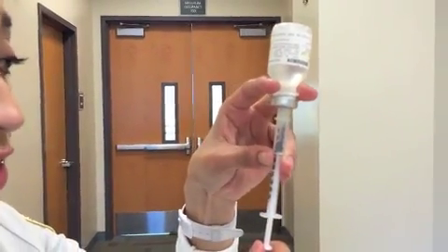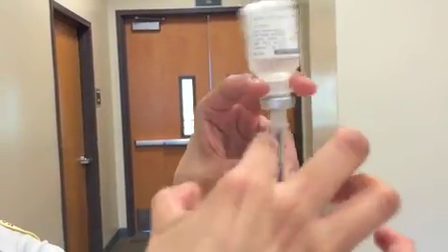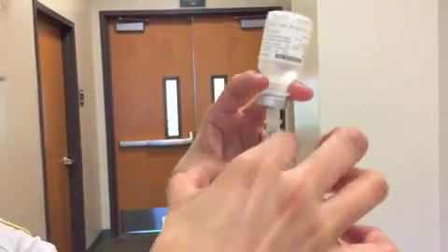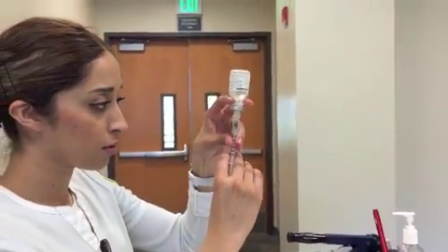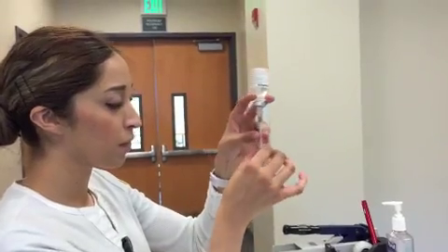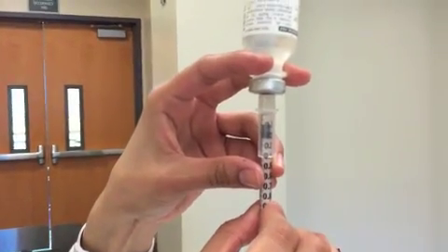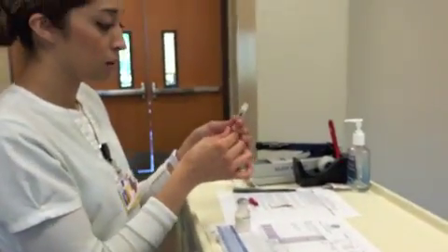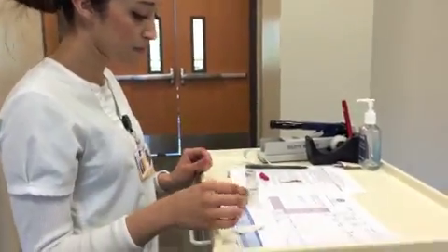Make sure you don't have any air bubbles in, so you can draw up further down, get all your air bubbles out. Some you really have to hit. And there it is, 0.1. The syringe you could just pull up and it's ready.